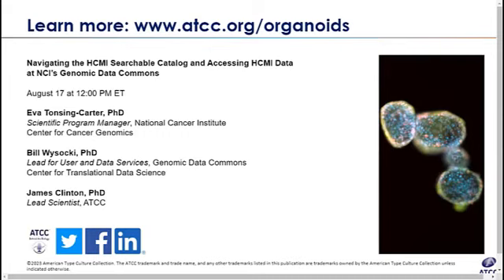Anything other than that is not considered personally identifiable information. We do have high-level clinical information, such as age and primary tumor site. We have some treatment history around therapeutics. We have maybe histology around the tumors and things like that. I will also add that ATCC does not directly provide any of the sequencing data.